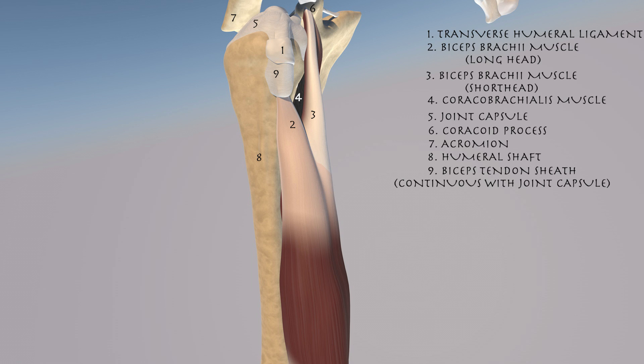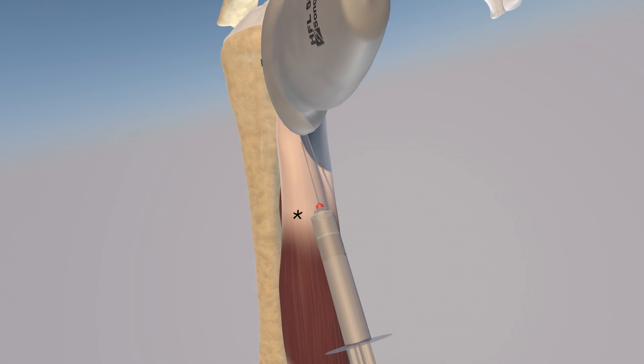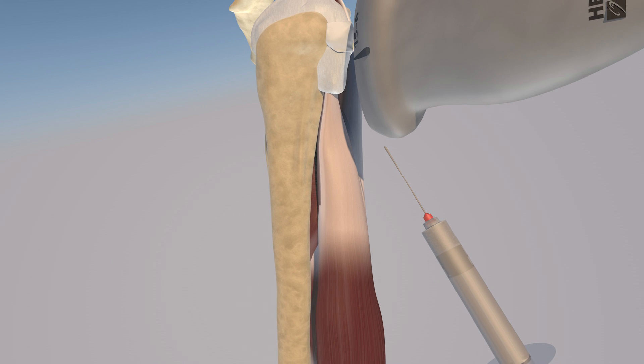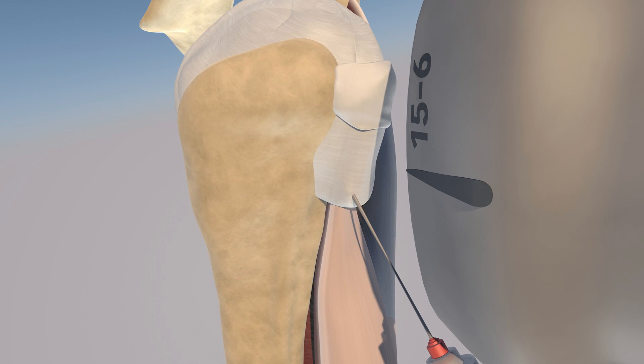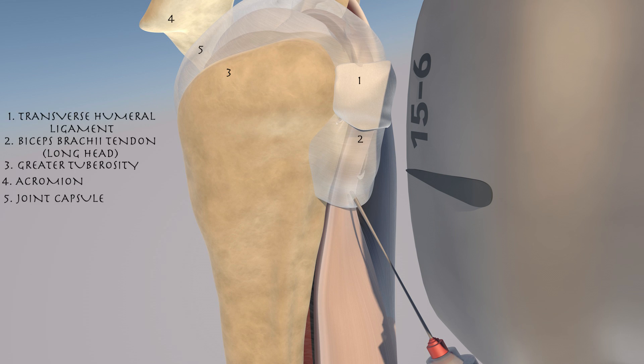Here we're going to go over anatomy, specifically of the biceps tendon sheath, where this injection is. We can appreciate the biceps muscle, both the short and the long head. This is the orientation of the procedure. This is an in-plane approach, long-axis view of the biceps tendon. The needle is entering the biceps sheath, and now we're starting the injection.